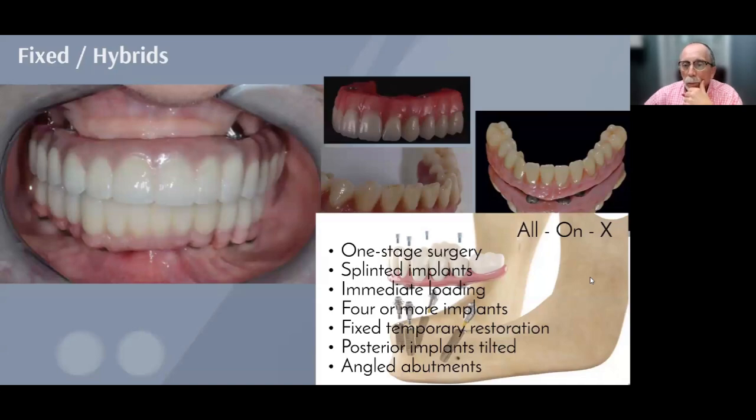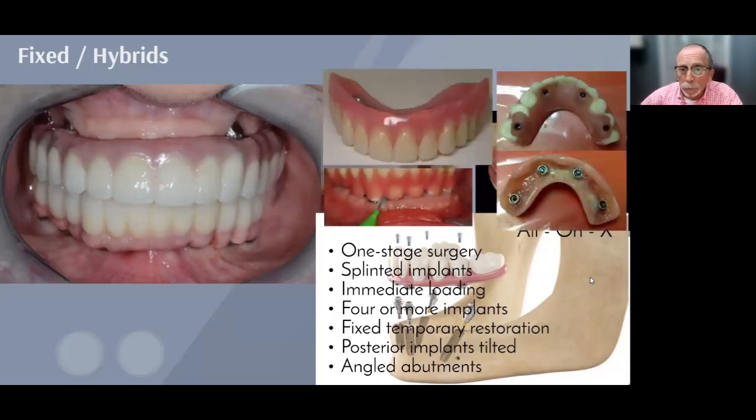If we're going to immediate load them, then we're going to put the MUAs on, and we're going to have our temporary restoration pretty much done through planning. Place the implants, put the temporary on, let everybody heal, and then good to go.